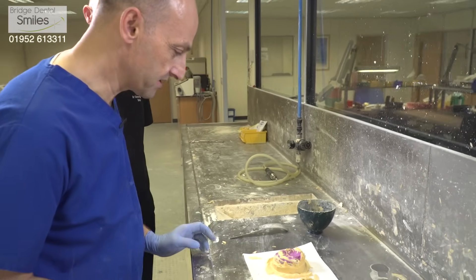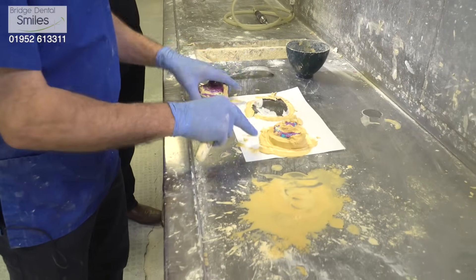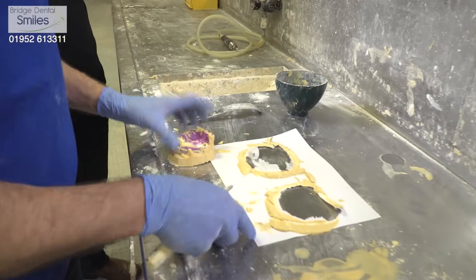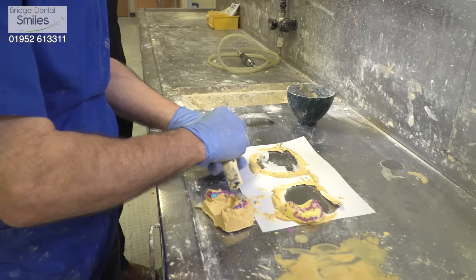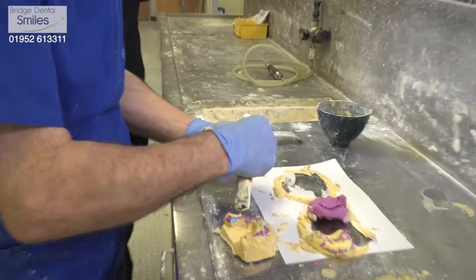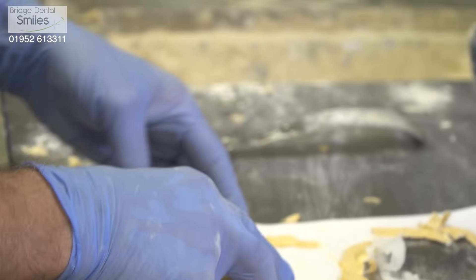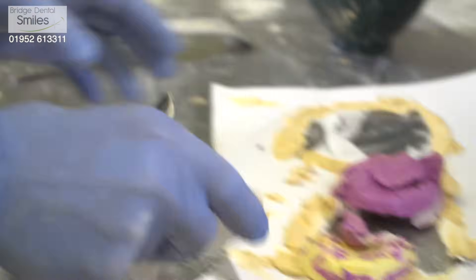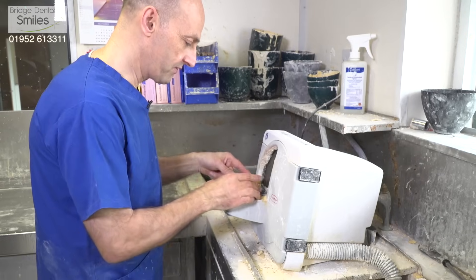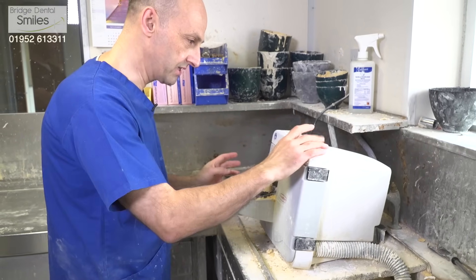So these are the impressions that we cast earlier — the plaster's now set. If we remove the alginate part of the impression, we then have our impressions of the patient's mouth that we'll begin to do the work on. We have the rough model, and now we're going to reduce it down in size and make it neat and tidy so we can work on it.